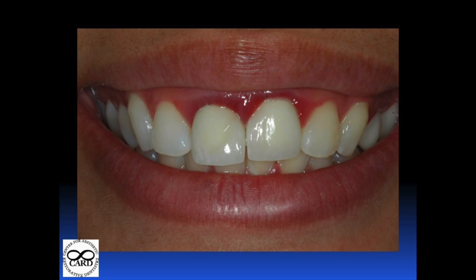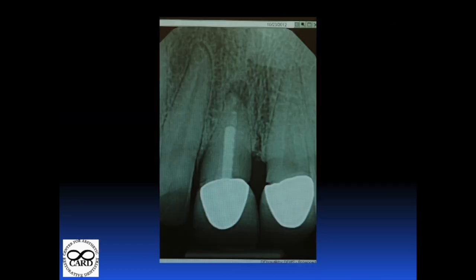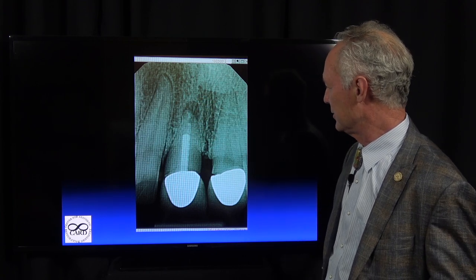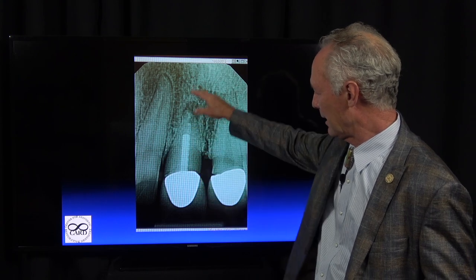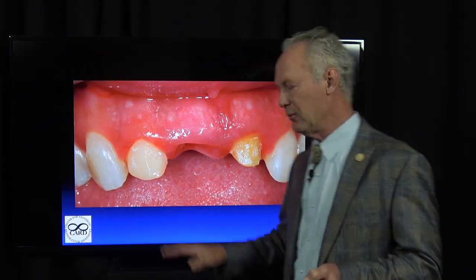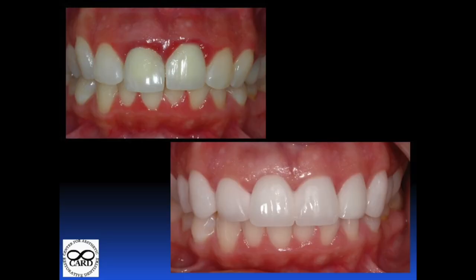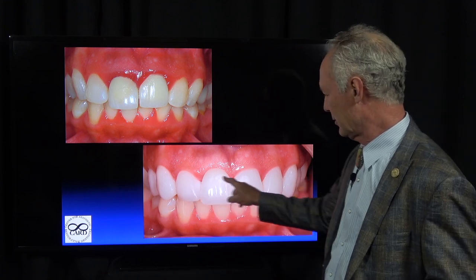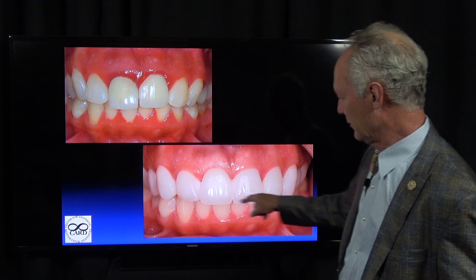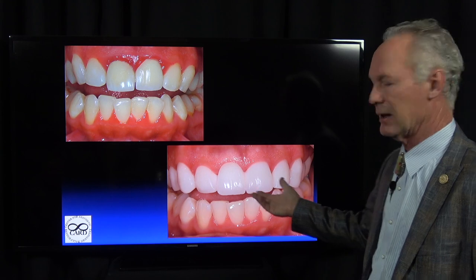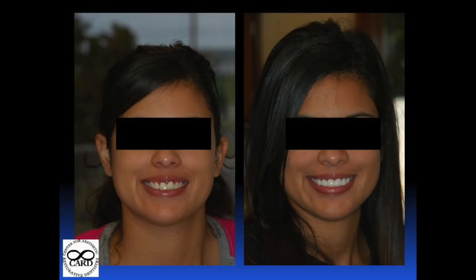If you're missing a central, I'll place a bridge from the lateral incisor to the adjacent central and then another veneer on the other central — the centrals and laterals are generally about a half shade to a shade lighter than the cuspids. This is another young woman who had fractured one of these centrals — she had an old post and fractured it right through. There was a lesion on the apex of the tooth. Since there was infection, I extracted the tooth and grafted the socket, then let that heal for two to three months with a provisional in place. We wanted to lighten the shade of the teeth, so we veneered back to the bicuspid. This is a fixed bridge from the lateral to the remaining central, then veneers on these teeth to lighten the shade. You can see — I had the gingival pontic receptor site so it looks like the pontic grew out of the gum. Very nice result.